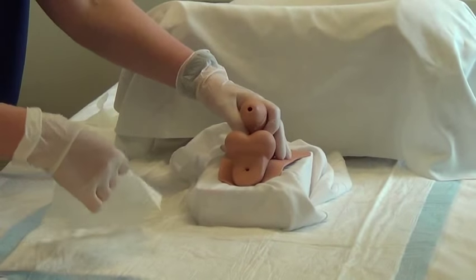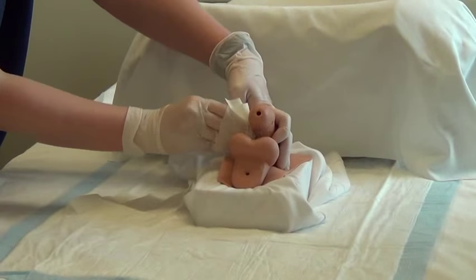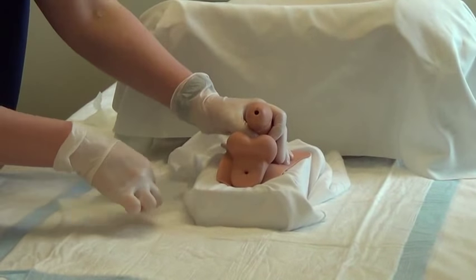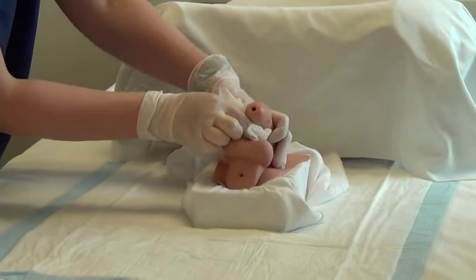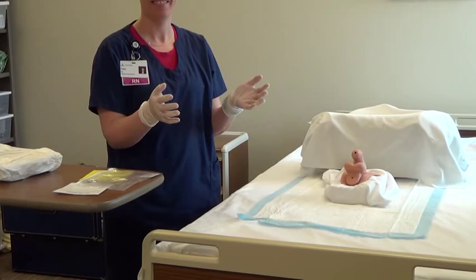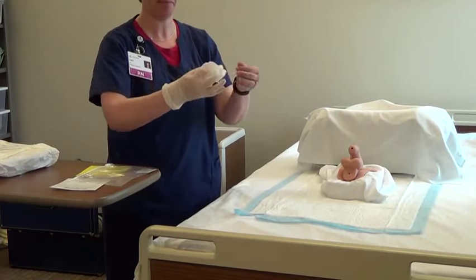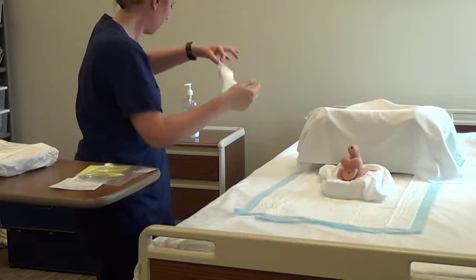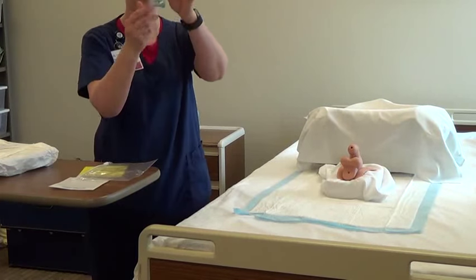With male patients, you should retract the foreskin prior to cleansing. The perineal cleansing is a step you may want your helper to perform. Discard your soiled gloves and perform hand hygiene. A hand sanitizer packet is included in the kit.